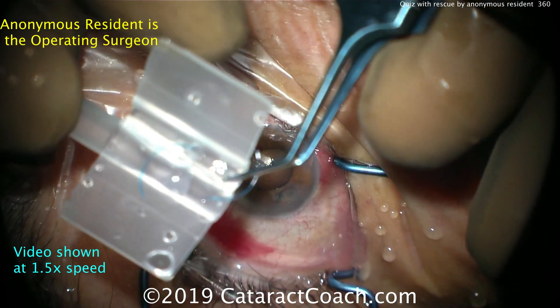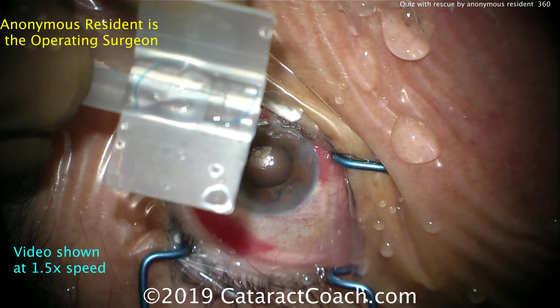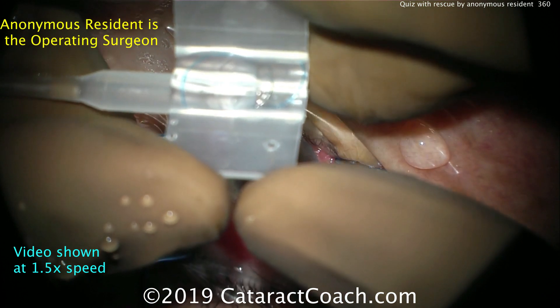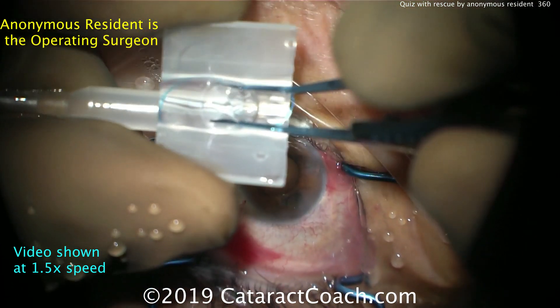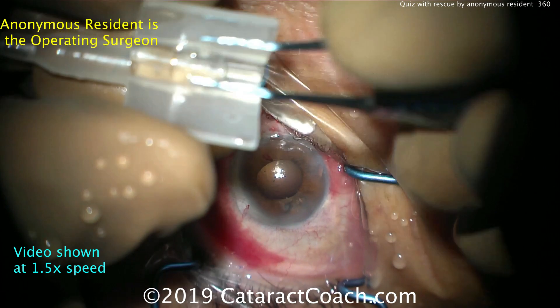This is a butterfly-type injector. The lens looks good, good orientation, and the haptics are in good position. Now we'll make sure that the leading haptic is in good form so it goes inside the tunnel of the injector. There we go — folding looks pretty appropriate, good folding of the lens.